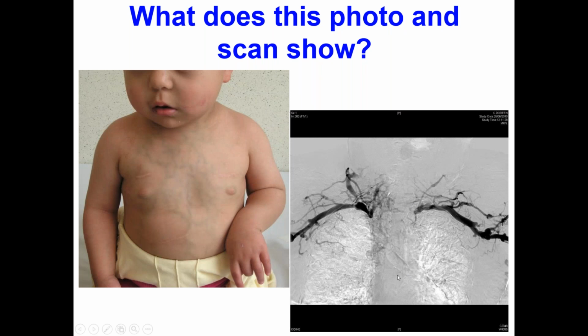This says to you that putting in any future line is going to be extremely challenging. You see clear stenotic areas. In fact, this child has had multiple balloon dilatations as well, and stents inserted. This also tells you that in the future, performing an arteriovenous fistula on his arms may also be a high-risk procedure and actually fail because the central drainage is so poor.